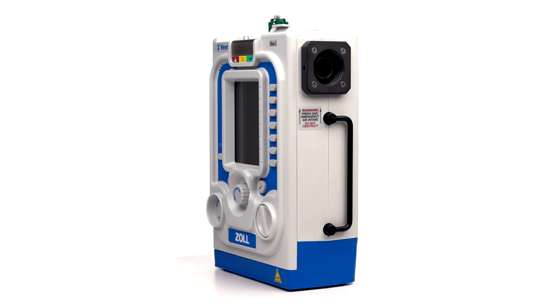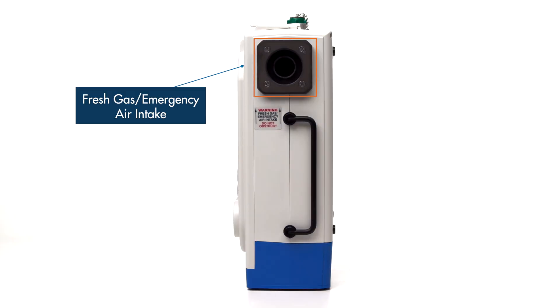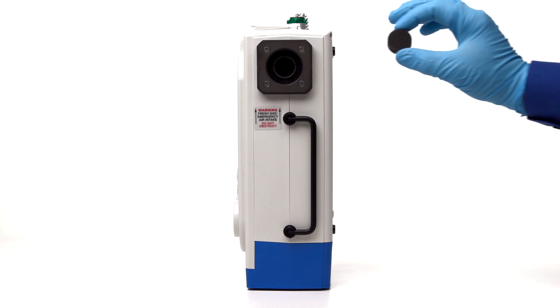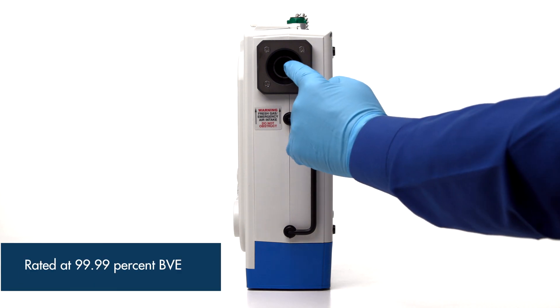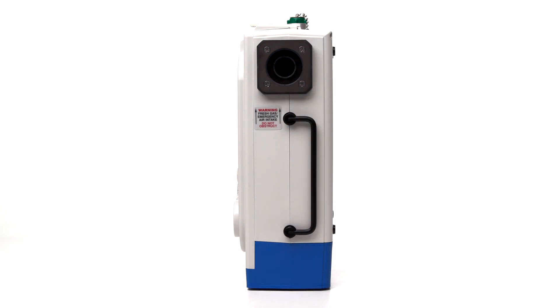Now we will look at the left side of the device. At the top is the fresh gas intake port, which allows ambient air into the device's internal compressor. The Z-VENT can operate either on room air or from an oxygen supply. Inside this port is the internal bacterial and viral filter rated at 99.99% BVE. This filter should need replacing during the regular annual maintenance. In the event of a ventilator failure during operation, this port is also the emergency air intake, which acts as an anti-asphyxia valve that allows the patient to continue to breathe fresh air.